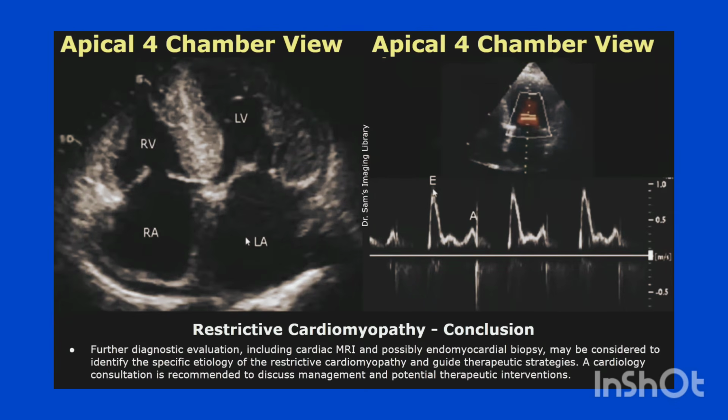Further diagnostic evaluation, including cardiac MRI and possibly endomyocardial biopsy, may be considered to identify the specific etiology of the restrictive cardiomyopathy and guide therapeutic strategies. A cardiology consultation is recommended to discuss management and potential therapeutic interventions.